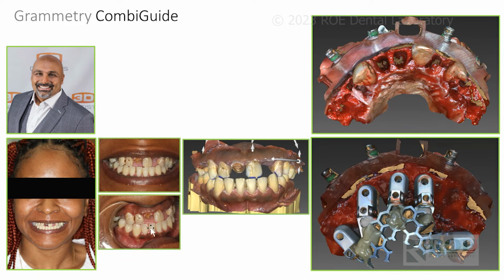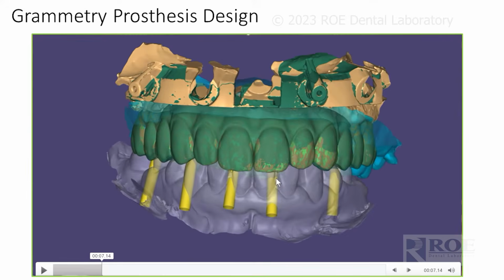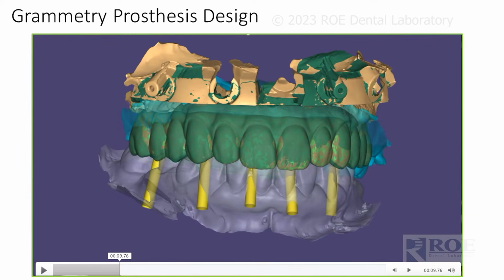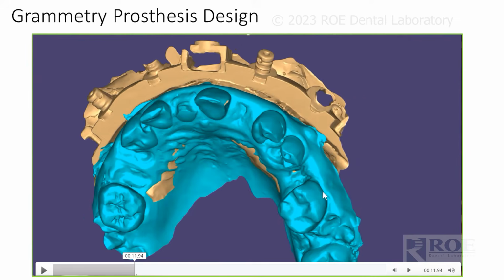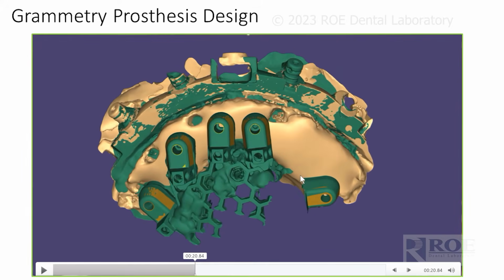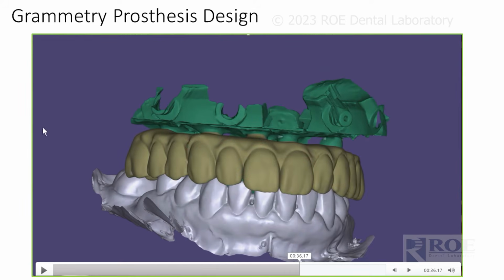Patient photographs. We have the bite to confirm before surgery photographs. We have the records. We have the cone beam. And then we go to surgery. And then based on this, we made her a lovely smile. And here's the fixation base scanned in the mouth, preoperative, teeth, scan of the opti-splint, opposing, and then we design the prosthesis.